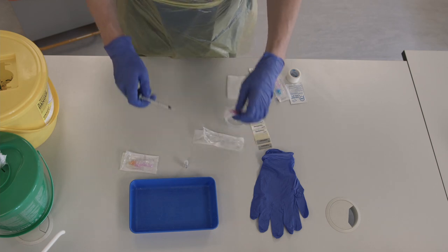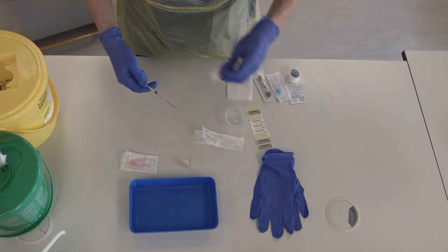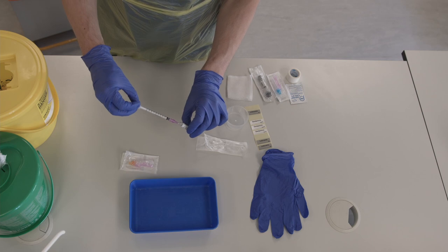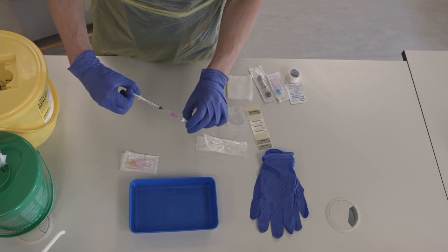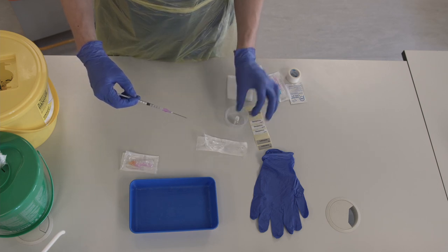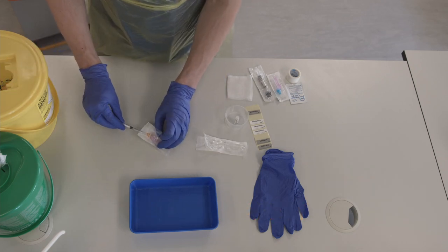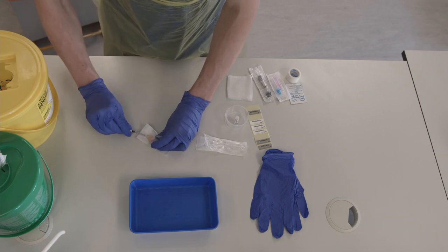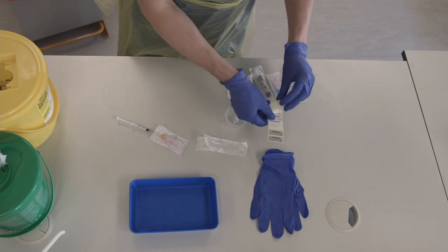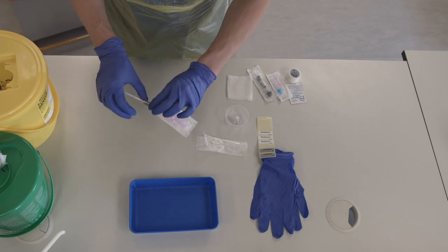Attach the filter needle to the syringe and draw up around 0.5ml of lidocaine. Throw away the filter needle immediately in the sharps bin. Then attach the syringe to the orange subcut needle and leave it in the packet. Label it and put it into your tray. Keep the lidocaine ampoule in a plastic tub in your tray for confirming at the bedside.